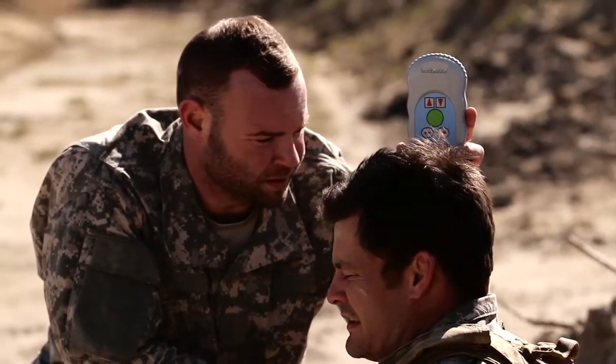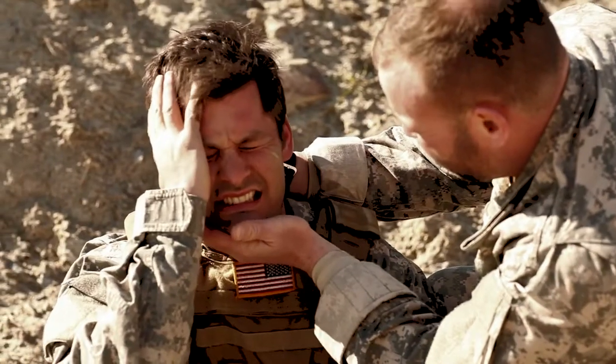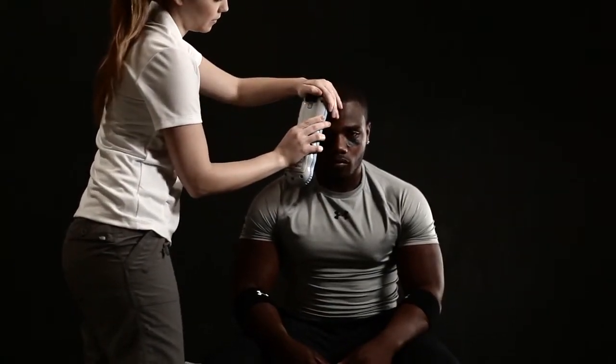If you get a positive scan, return to the left side and repeat the measurement two additional times to verify the positive result. To protect patients from cross contamination, simply discard the disposable fiber optic shield. If the patient is uncompliant or combative, stabilize the patient with your free hand. This device has been used in sports medicine with professional and college football players to evaluate concussions and determine whether a CT scan is indicated — using it as a triage instrument to more effectively utilize CT scanning.